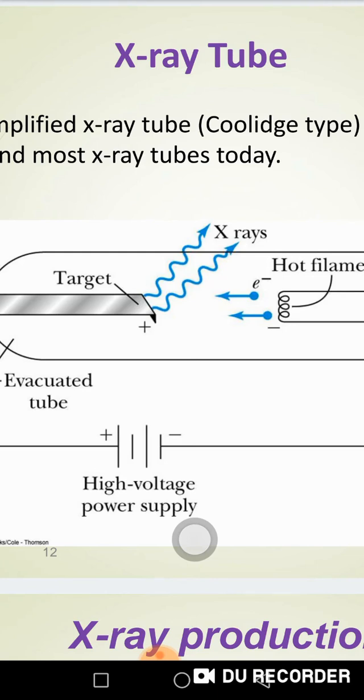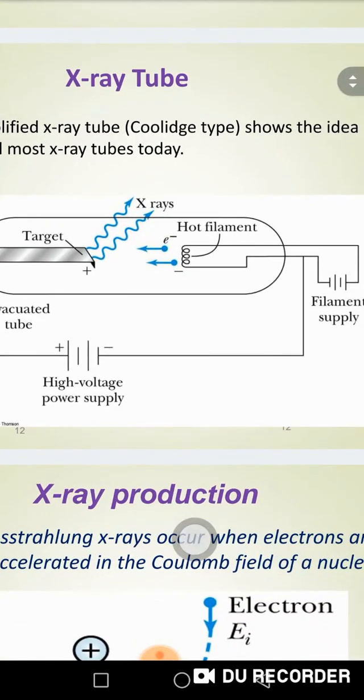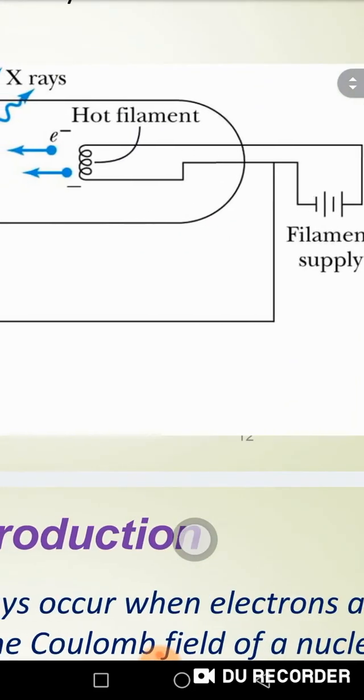The first thing you need to understand well when we talk about X-ray production is the electric current. Heat the filament to a certain degree. If you increase the milliampere, which represents the electric current that will flow in this circuit, then the milliampere is the control of the electric current. Increasing the milliampere value, for example, to 50, 100, 200 milliamperes, and so on, causes the filament to heat up to a higher degree.